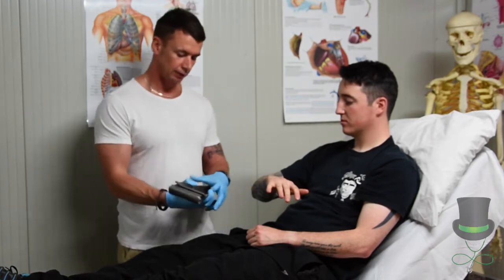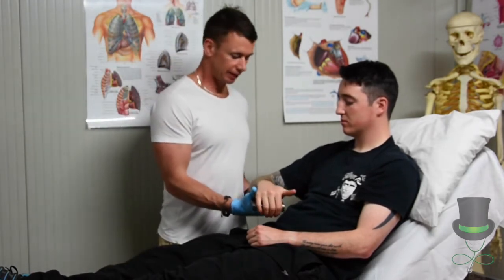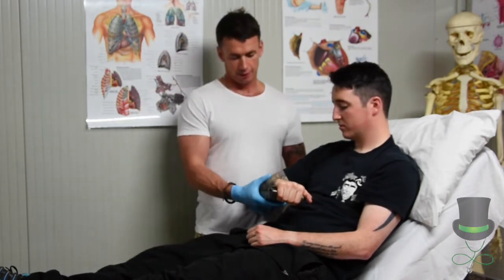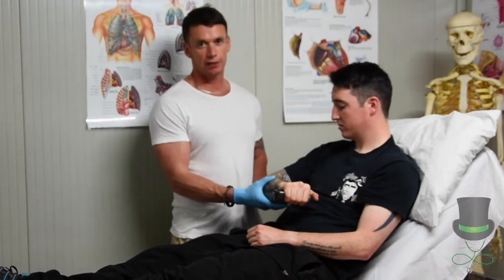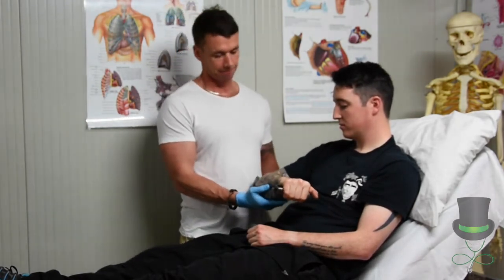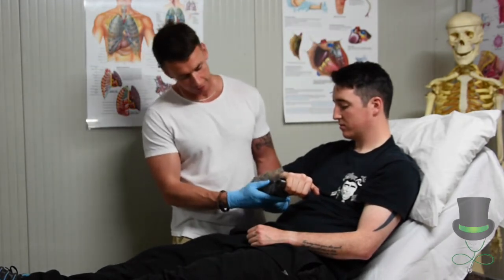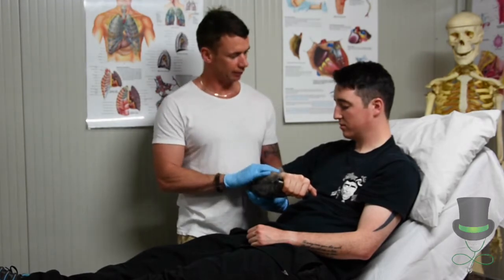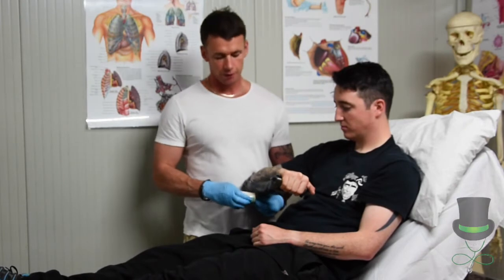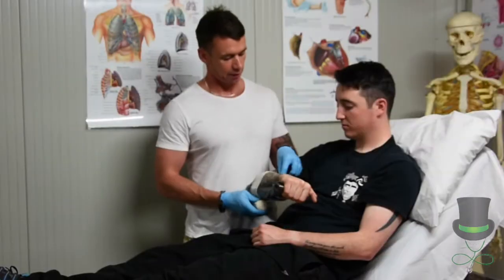When we're happy with our shape, place the splint under the wrist of the patient. It's important when we're splinting anything that we immobilize the joint above and below the site of injury. When our SAM splint is in place — does that feel comfortable? Yeah, excellent.